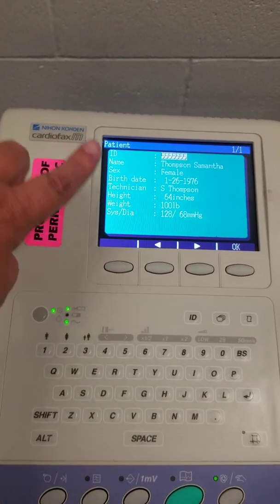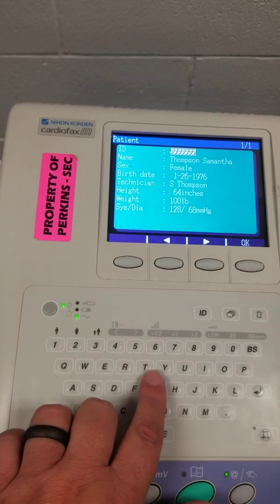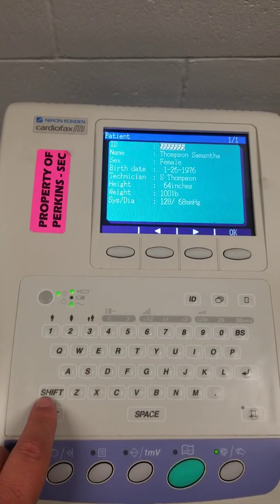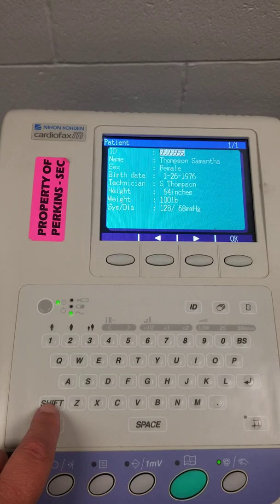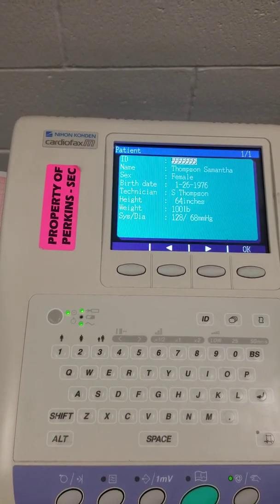When you put in the information, you're going to use this keyboard — it works just like a real keyboard. So if you need to capitalize a letter, you're going to do a shift key at the same time you hit the key you want to capitalize.